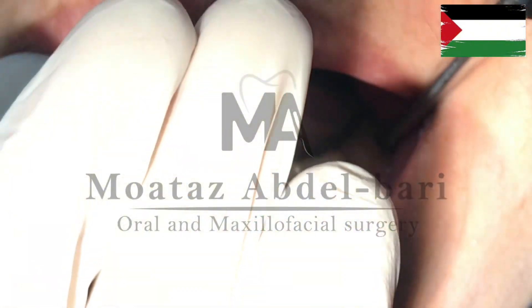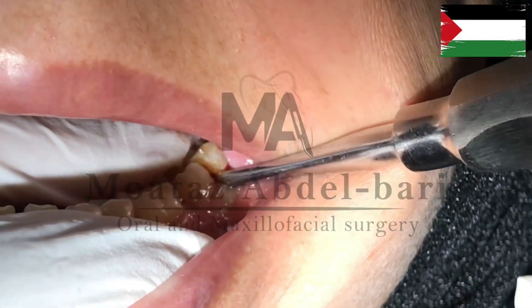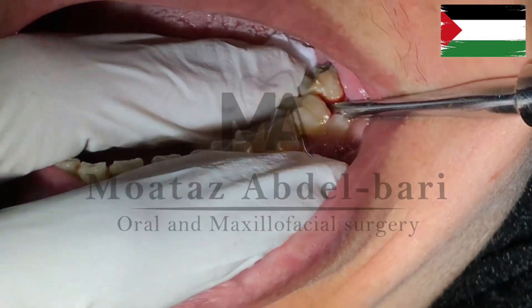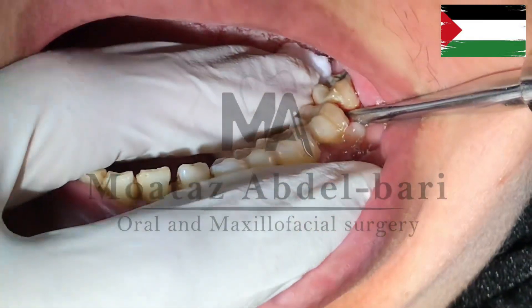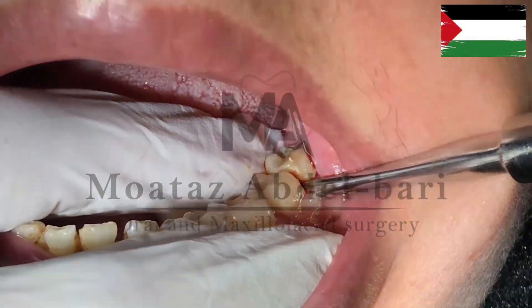Upon sensing luxation, reinsert the elevator into a more apical position until it is pure perpendicular, then rotate the blade of the elevator counterclockwise while simultaneously moving the handle apically.